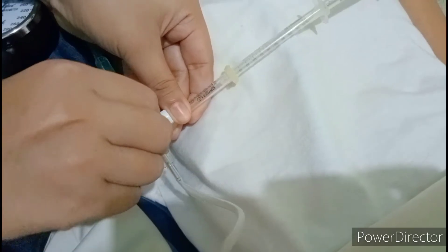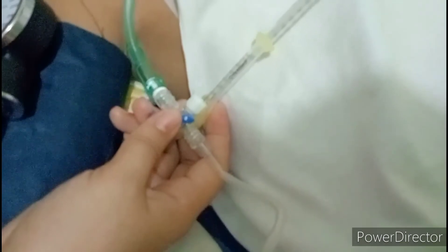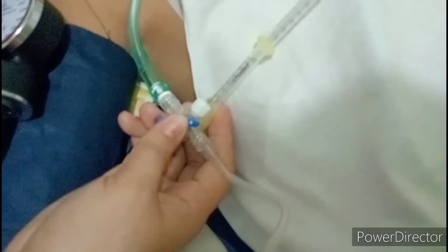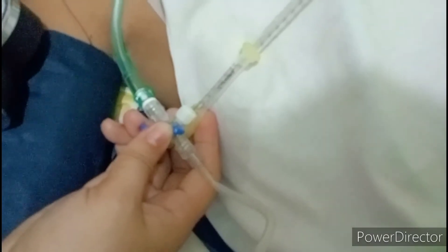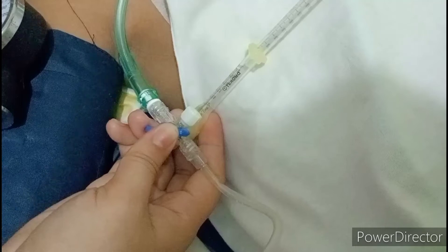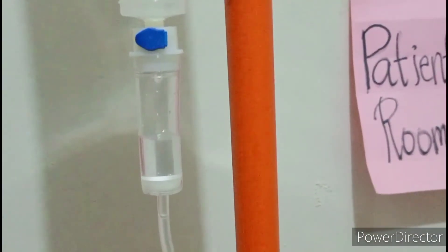Next, turn the stopcock toward the client. Then slowly fill the manometer with IV solution until the fluid level is about 10 to 20 cm higher than the client's expected central venous pressure value. Do not overfill the tube. Read the measurement at the bottom of the meniscus at the midline of the small floating ball, and note the central venous pressure at the end of the patient's expiration.